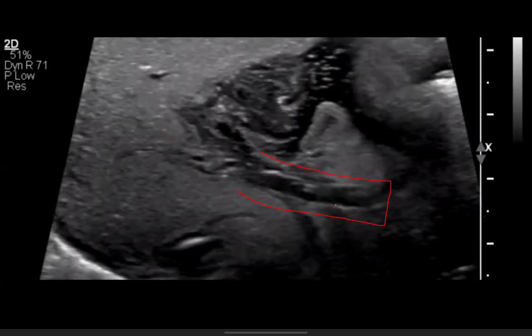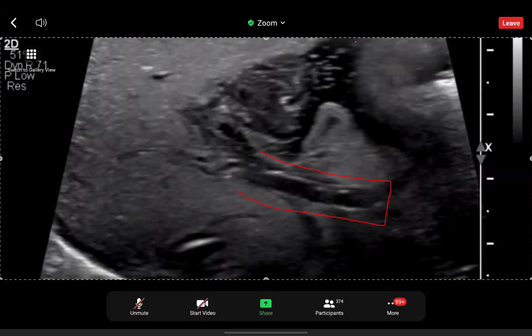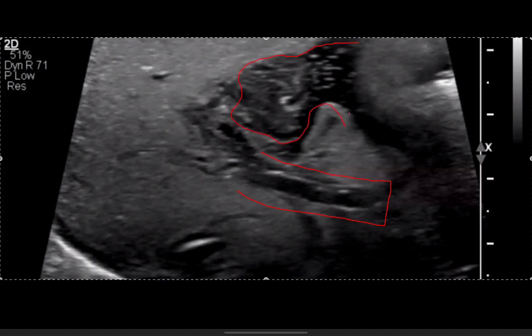We can see when we do an ultrasound of this child that there are definite small bubbles of portal venous gas moving through the main portal vein. And this area here is all complex free fluid at the porta.